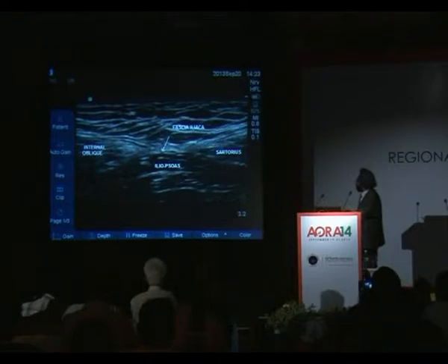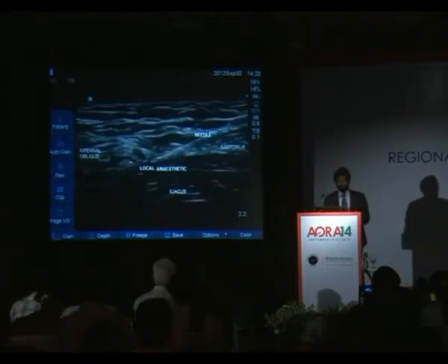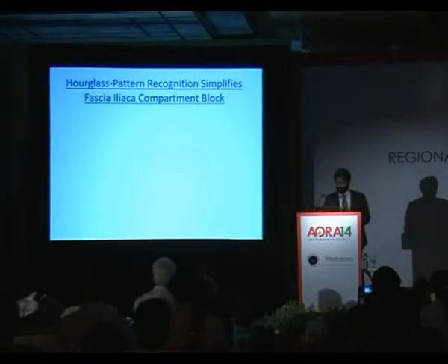All you need to identify is three muscles. You have the sartorius, which forms the caudal part of the hourglass. You have your internal oblique, which forms the cranial part of the hourglass. And you have your iliacus muscle, which has completely different fibers running in a different direction, lying in there. And then the fascia iliaca, which can be seen covering the iliacus muscle. The disadvantage of not having any arteries and nerves becomes our advantage, that we don't have anything in our needle trajectory that we can harm.